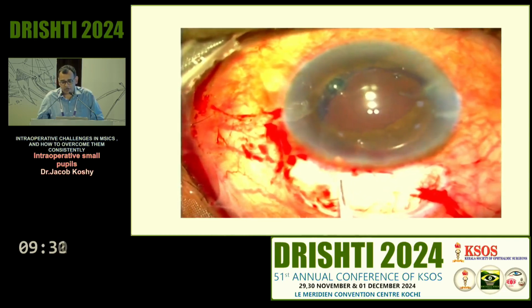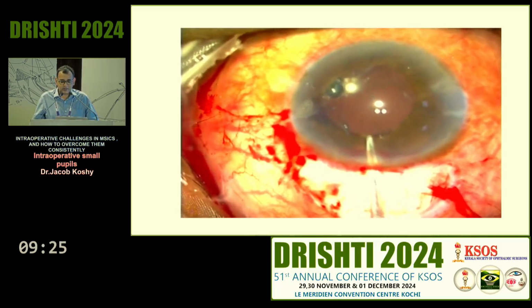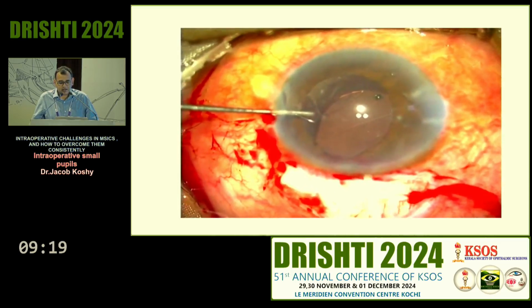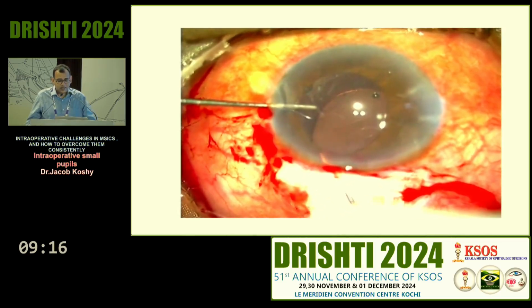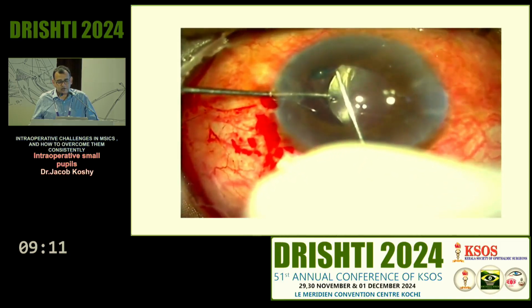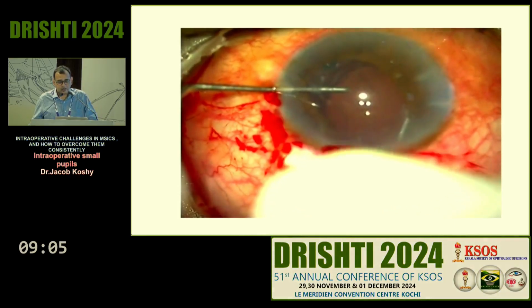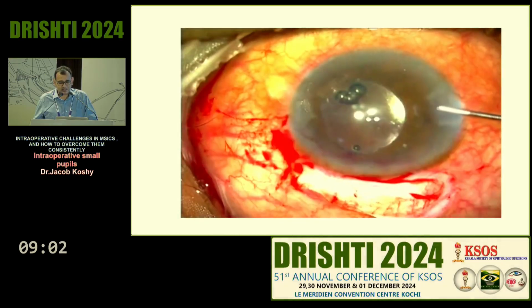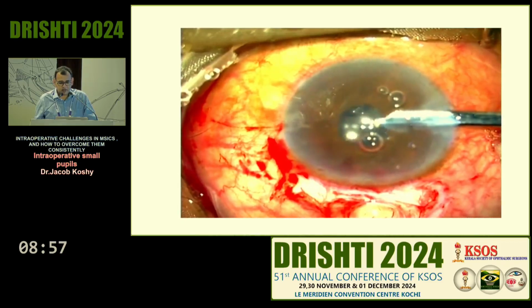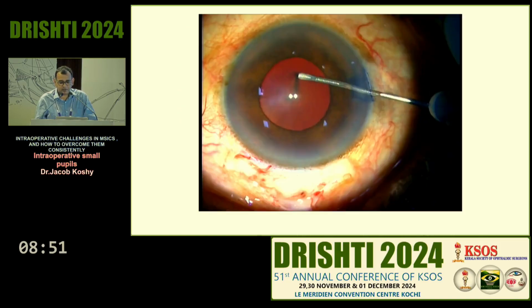Now here I decide to put in a PMMA lens into the bag without a CTR, using the haptics to stretch the area of subluxation. And the technique I use here, which I have learned, is I put a second instrument under the optic, especially if you want to put it in the sulcus, so that it helps you guide it better. Whenever you're putting a secondary IOL in the sulcus, in this case I'm putting it in the bag, put in some pilo, and make sure you've done an anterior vitrectomy. I've edited some of these things in the interest of time.